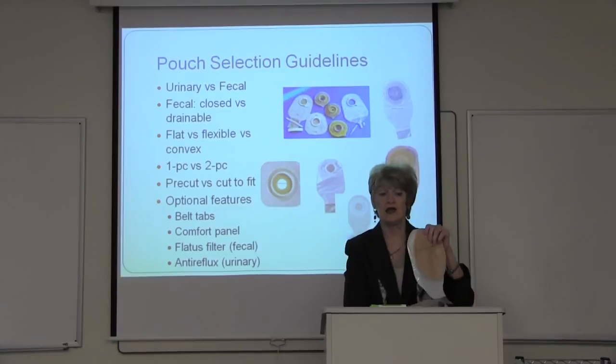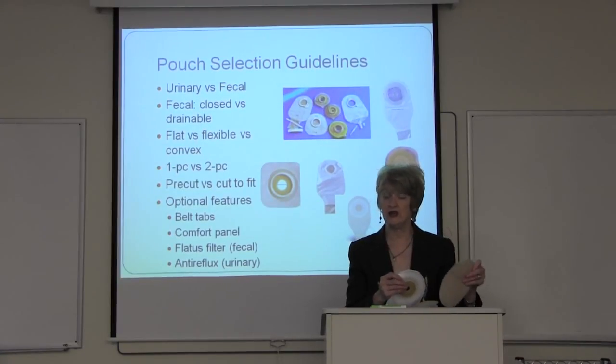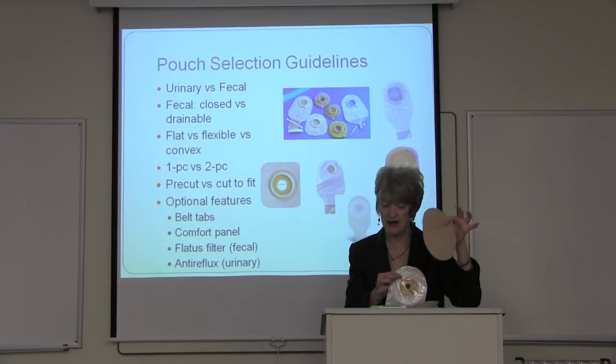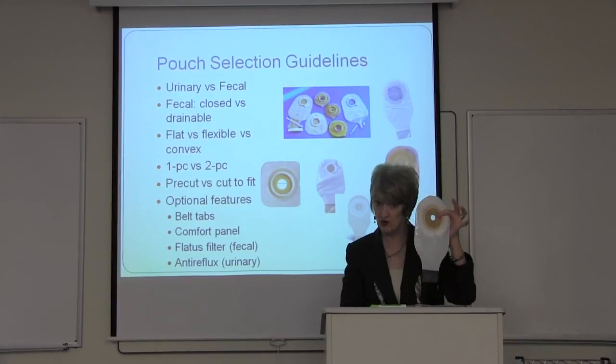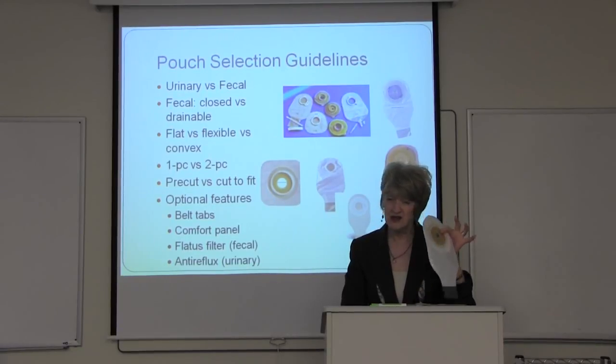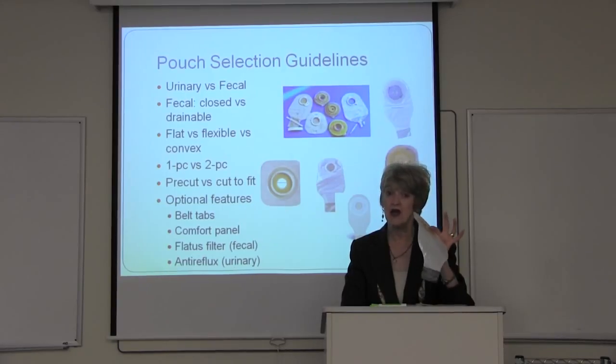So typically, even if we have a patient with a left-sided colostomy and we think, yes, within the next few weeks we can move you into a closed-in pouch, we will usually start with a drainable pouch, and we'll tell them why. This is not what you're going to be wearing all the time, but we need to teach you how to manage this, because this is what you will need to use during episodes of diarrhea, and you always need to keep some of these on hand.